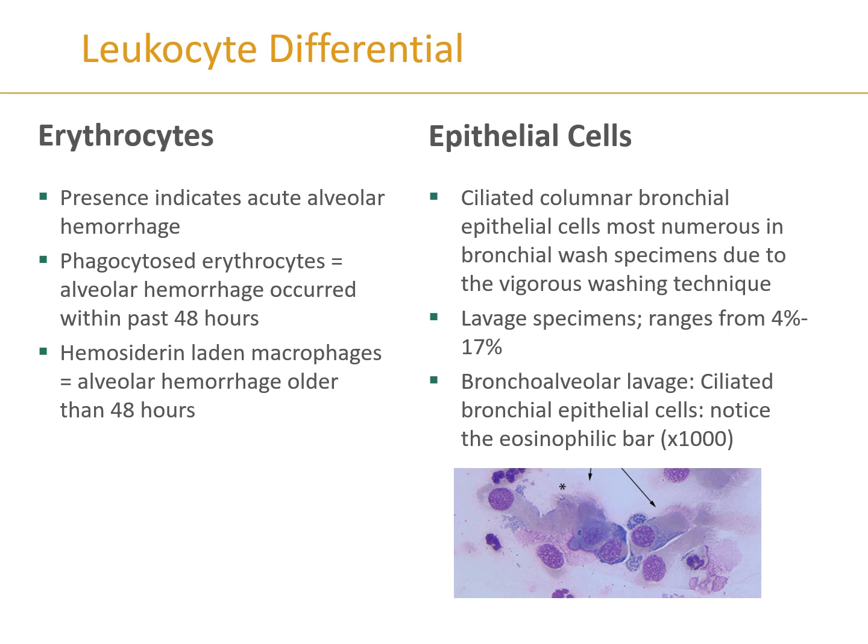However, if you start seeing hemosiderin-laden macrophages, where you see that darker brownish, orangish, blackish color within those cells, then that means it's an older hemorrhage, so that has happened longer than 48 hours ago.